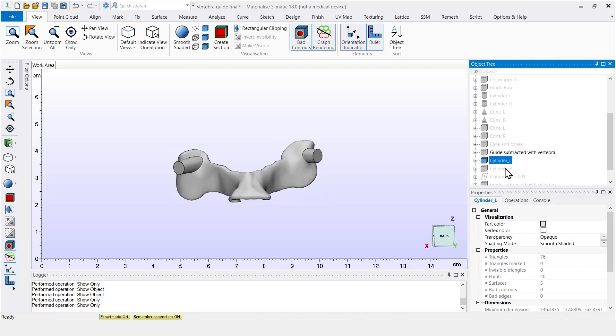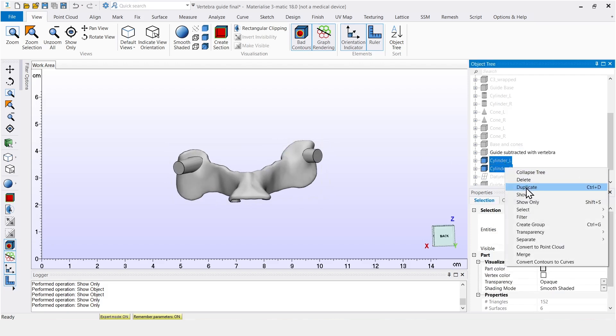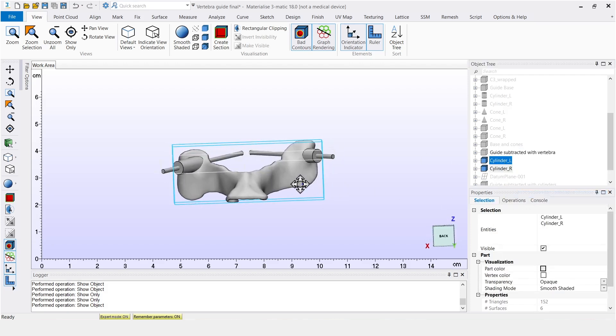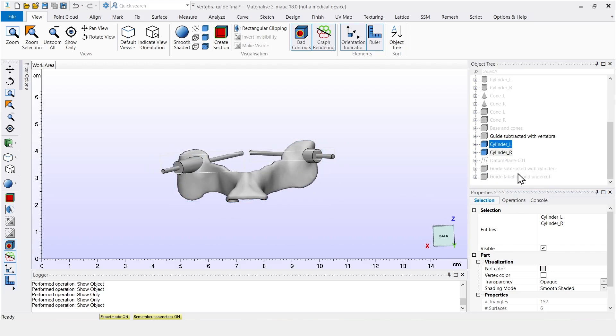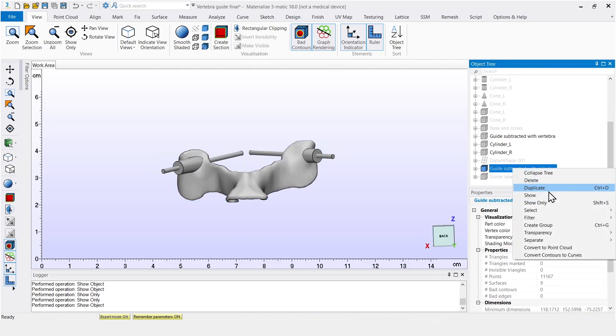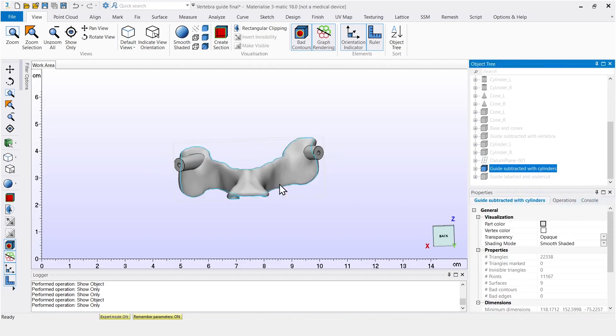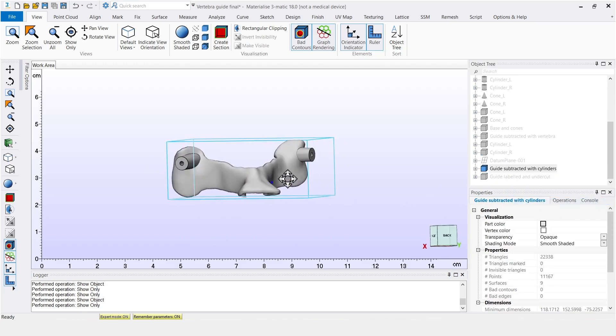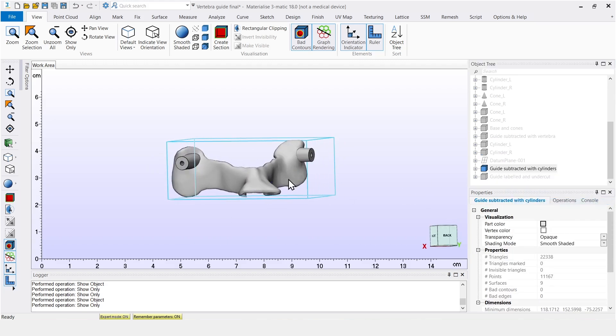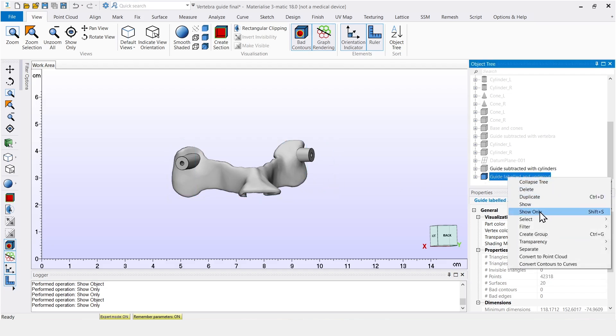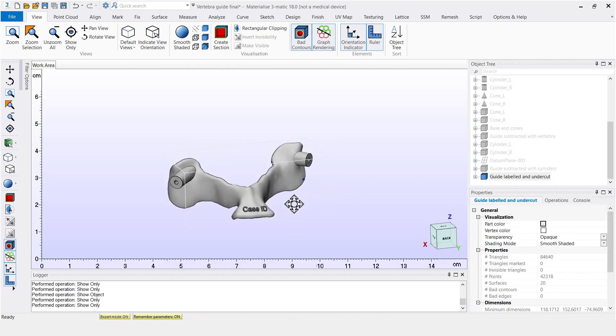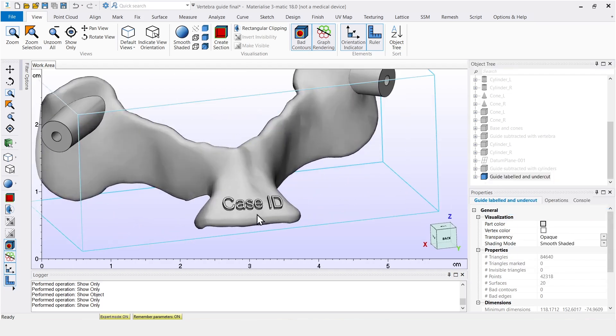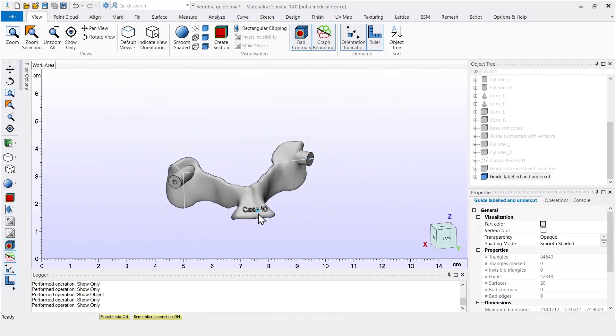After that, we can design smaller cylinders that can be used to make the holes inside the cones. And the guide really starts to take shape here. Though there are still a few small things that need to be done. We can add a label to it, which can be customized. Here I've just put case ID as an example.